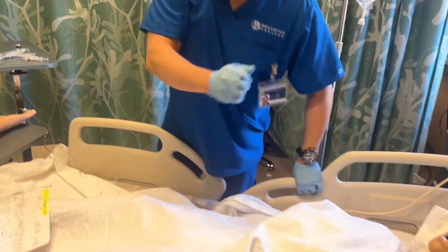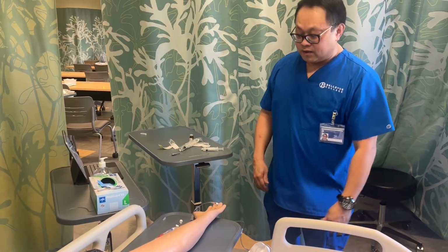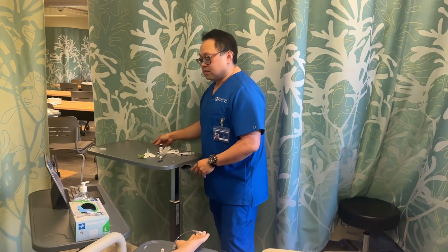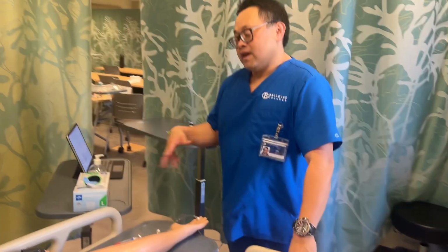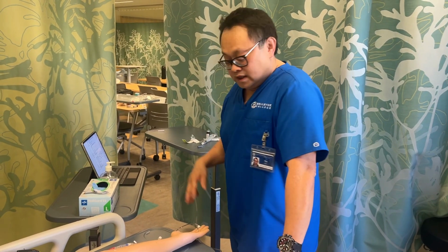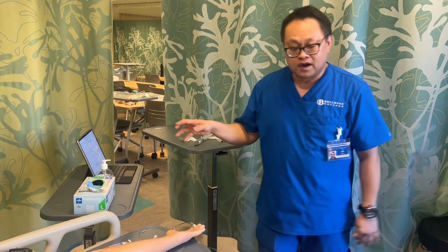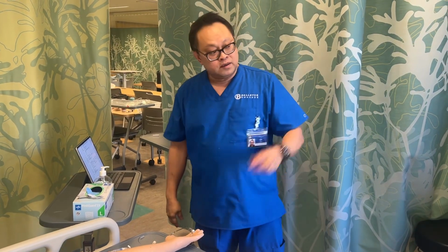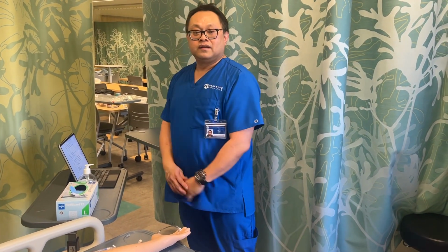I'm going to lower the bed, place the call light within reach, make sure the rails are up for safety, and I'm going to check back in 15 minutes. But before that, I would hand sanitize, and I'm going to document how they took the medication, if there was any phlebitis that we checked before we gave them medication, how the site was. But I already said that we check the site before we administer the medication, how the skin was looking, the medication, the date, the expiration date, and chart all that, and that's it.